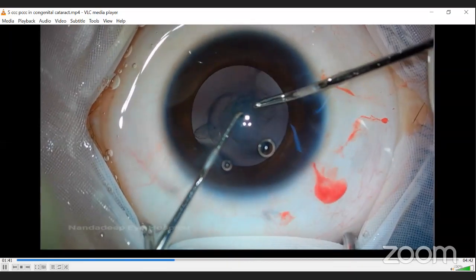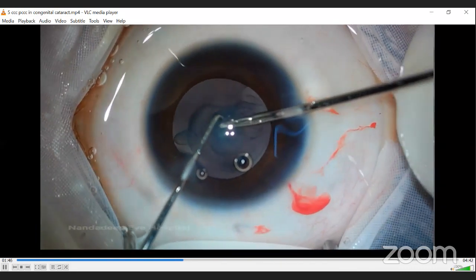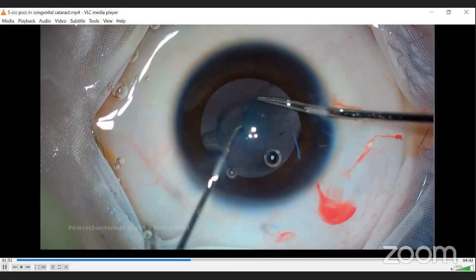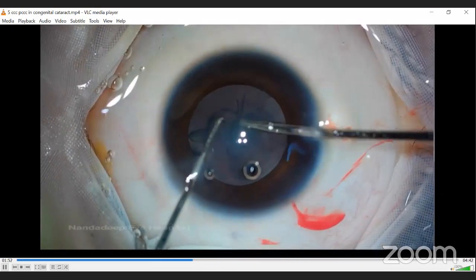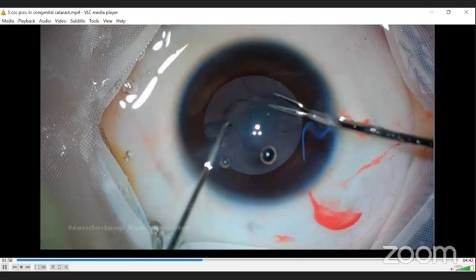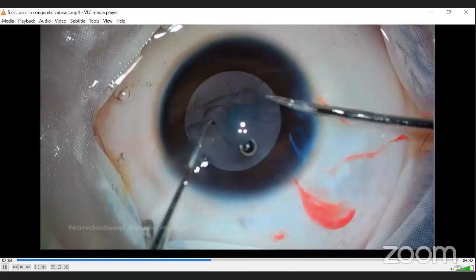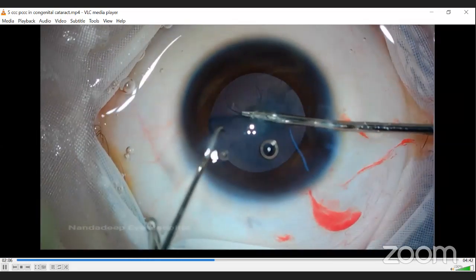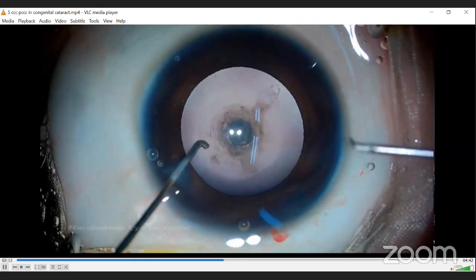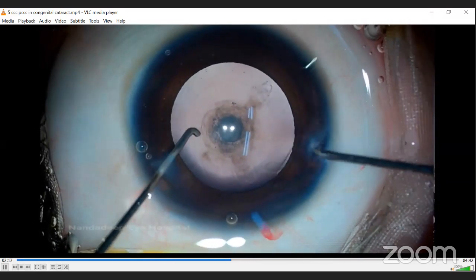The moment you use shearing anytime in between, you will find the rhexis is becoming larger. So only if the rhexis is becoming very small, you have to use the shearing force a very little bit, and then again go back to tearing force. So this is where tearing is more important than shearing. And always hold the torn edge very close to the torn margin. Never hold it far away from the capsulorhexis edge because it tends to go out very quickly.